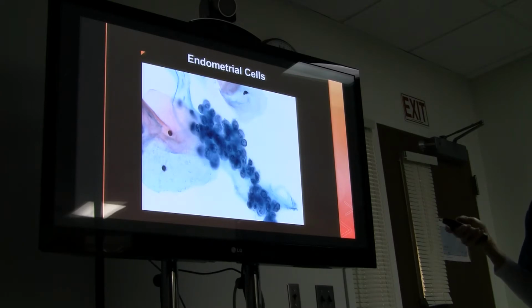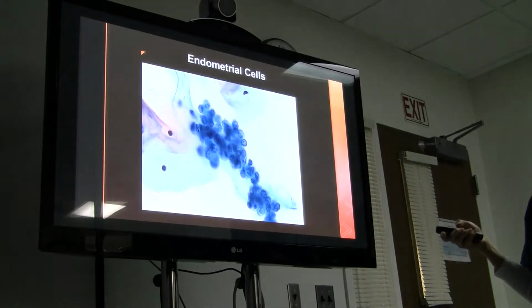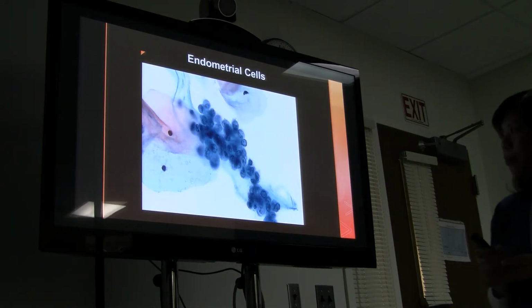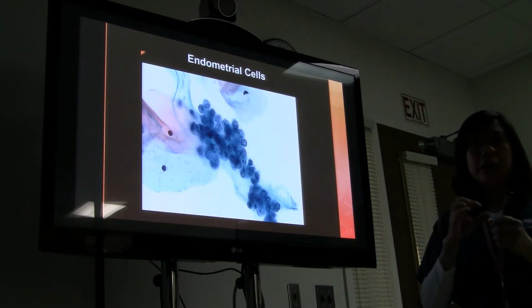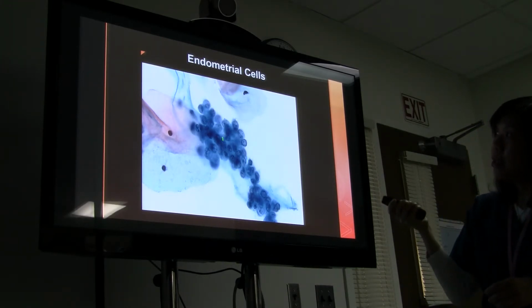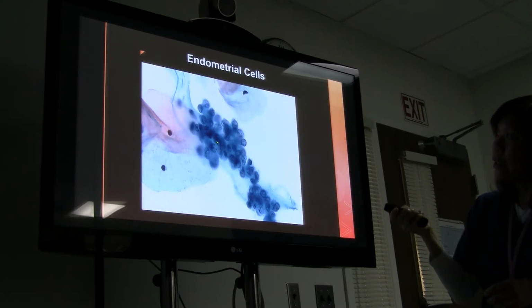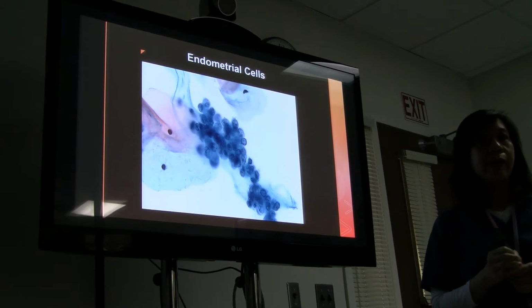If there's an intermediate cell nearby, let's see, we don't have an intermediate cell nearby. I have it on the slides later. You would expect to see the whole cell here is about the size of the intermediate cell nucleus. And it has a tiny bit of cytoplasm. See all this little fuzzy kind of greenish, bluish stuff? Those are the cytoplasm.